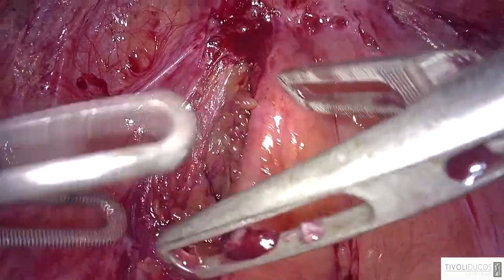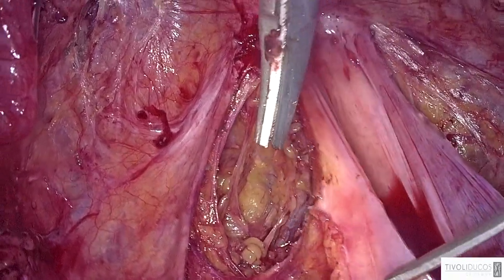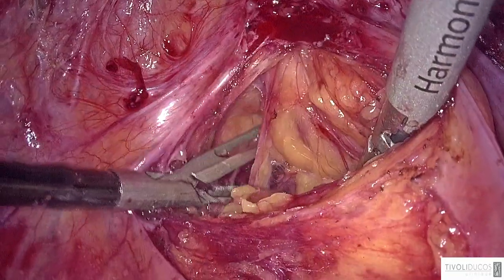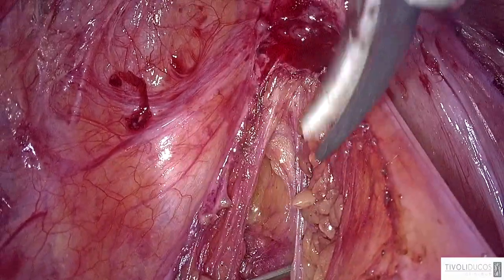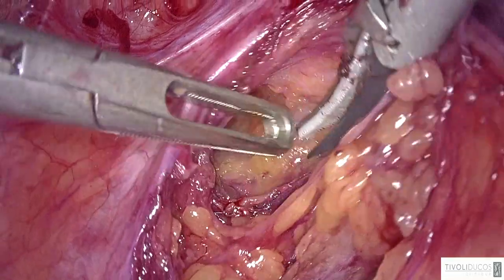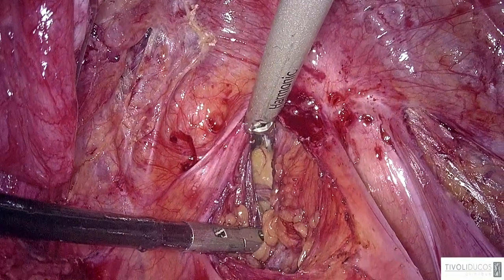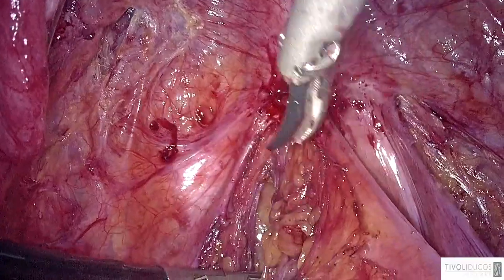Horace, you're going with a small bite, so which... Sorry? Small bites. I don't understand. Sorry, could you ask me once more? There's a problem with the microphone. I change it. So you are doing the surgery with small bites, which gives you the ability to block this area, right? Very small bites. Oh, okay. You can comment on that, please. Okay.